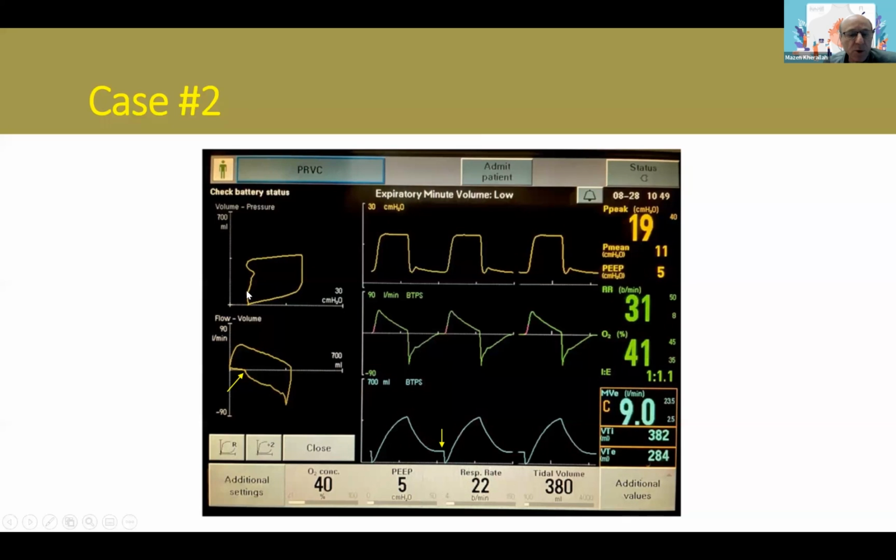However, the volume doesn't go back to the zero level in the volume. It goes down to the PEEP level. This is the PEEP level. However, it stops here and recalibrates. Of course, you need to complete the loop. This part here is the volume that is leaked.